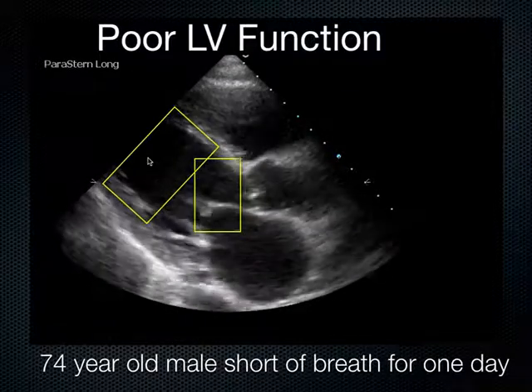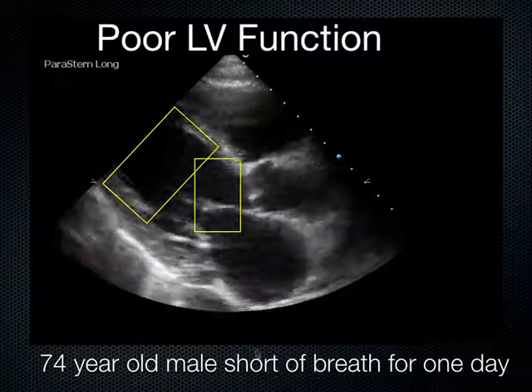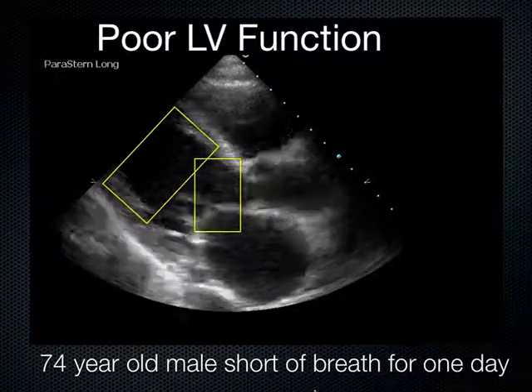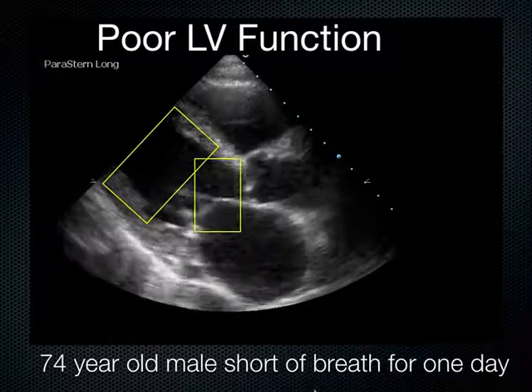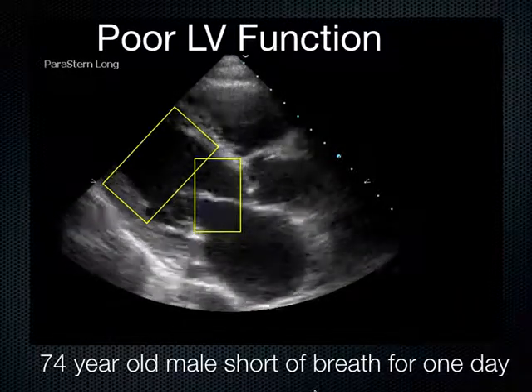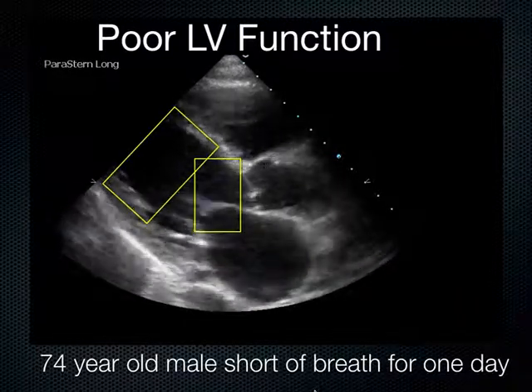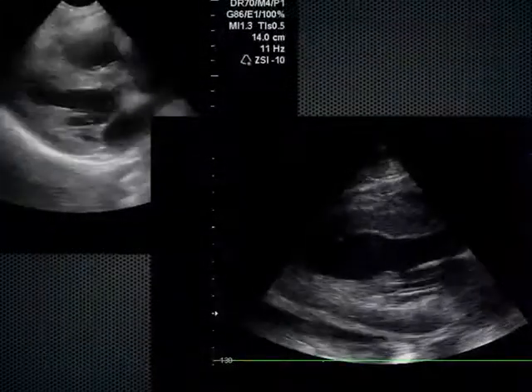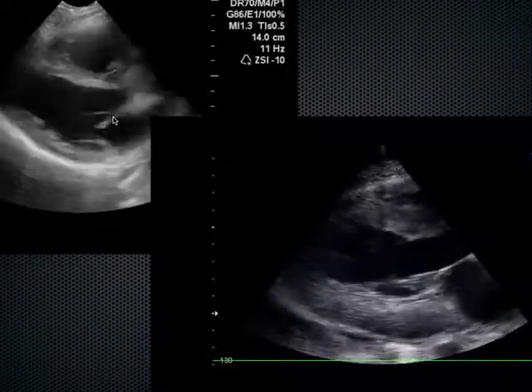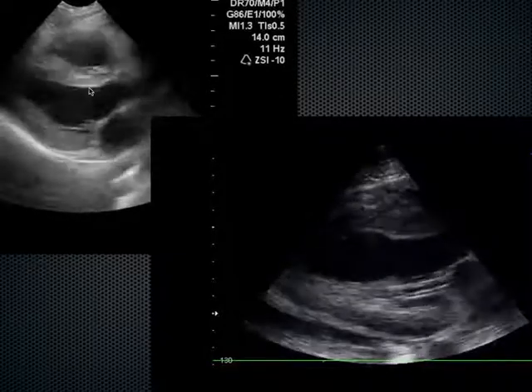So in this case, this patient has poor LV function, and I know that I'm going to need to be very judicious with the use of fluids, especially if they have shortness of breath. Okay, so this patient may only get better when given inotropes to help that heart squeeze better, and I have very good direct visual evidence of that. See, because normally that mitral valve should come up and smack that septum. Can you see that there?